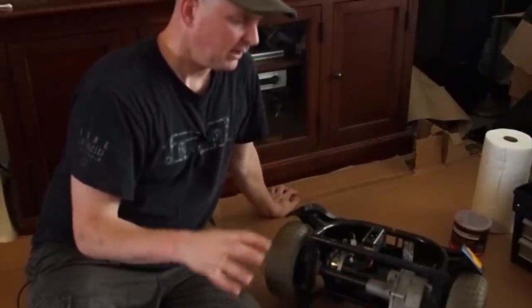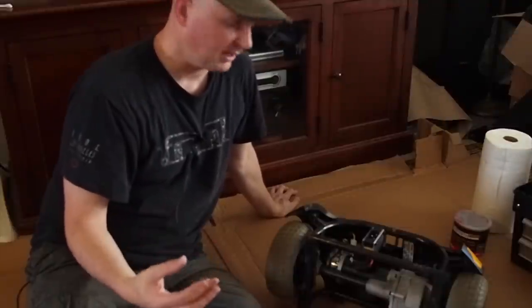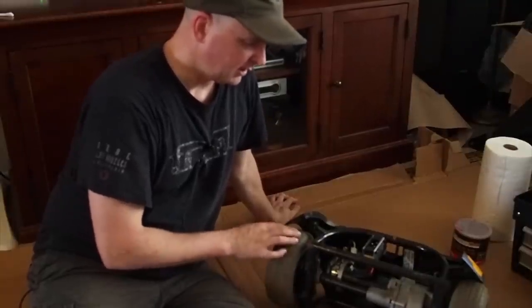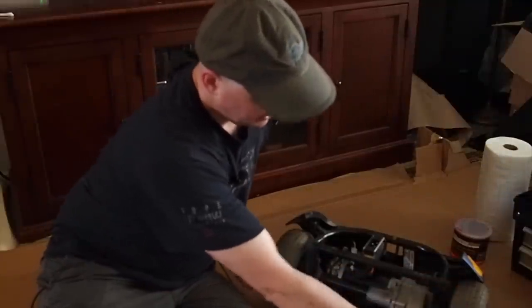whole thing too tightly. When it is slowing down or when it's in reverse, you hear a terrible grinding sound. I think that was just because I built it too tightly. I think it's built properly. As you can see, the wheels turn in opposite directions. They'll go together. You can hear that noise there.